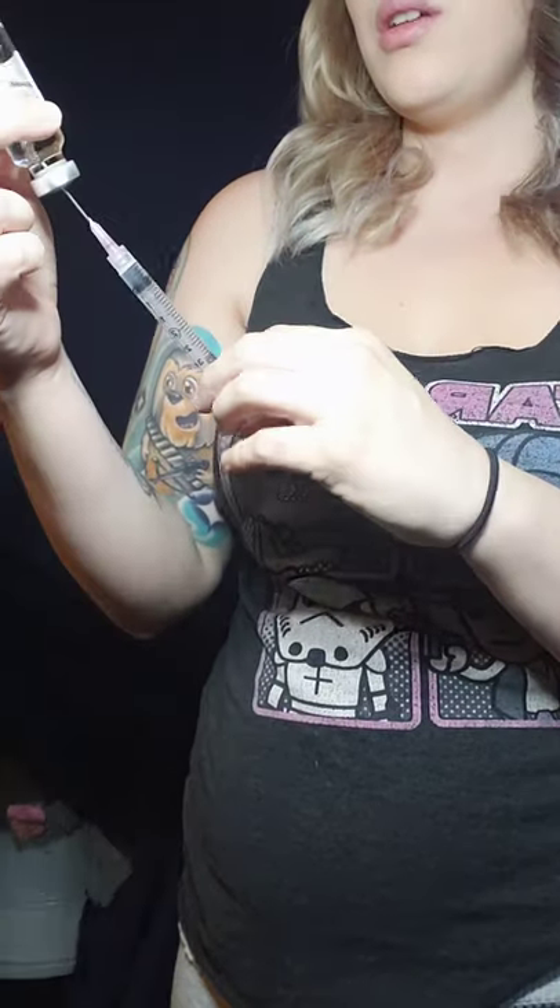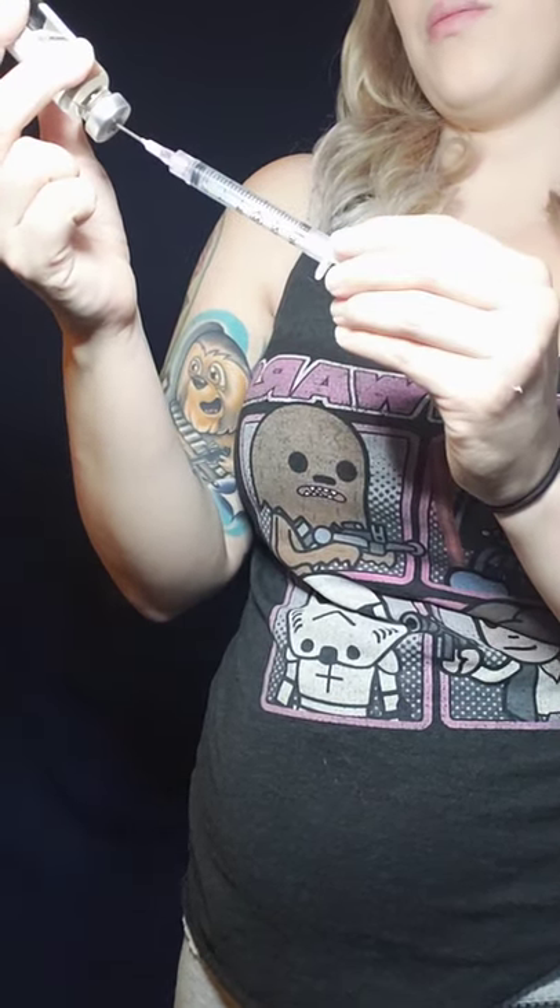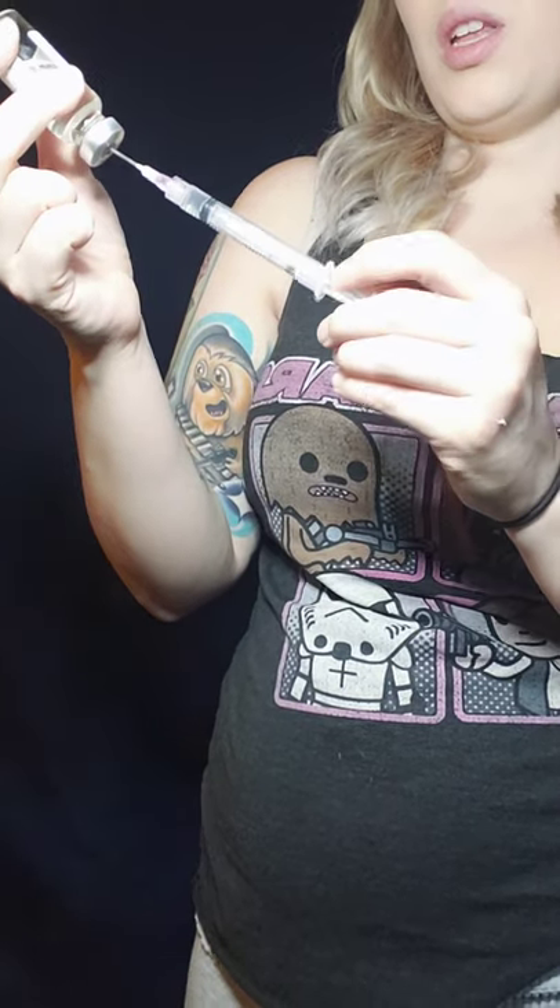It's huge. There's a small child walking in — hi Eliana! Pull it out just a little bit. Fresh, clean, wrapped, already wiped down my vial. Push the air in slowly, pull back. There's always a little air bubble — try and get that air bubble out.